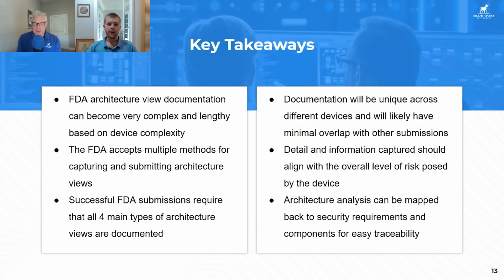Yeah, and that clinical decision support, I think, is a great area to bypass some of the controls. Pretty much. Yeah, it's saying, oh, we're not actually making the decision with the device. We're still pushing this on to the clinician, which we are. It goes back to our conversations that we've always had around where blame can be assigned if something goes wrong with a device like this.